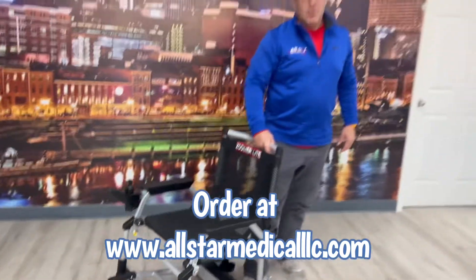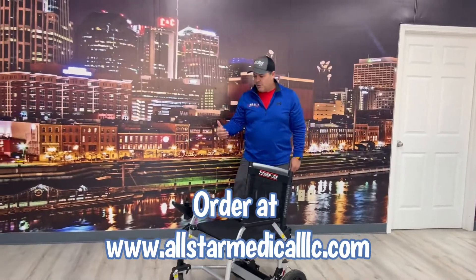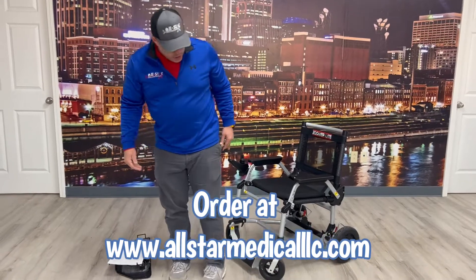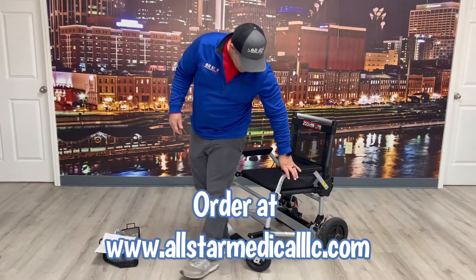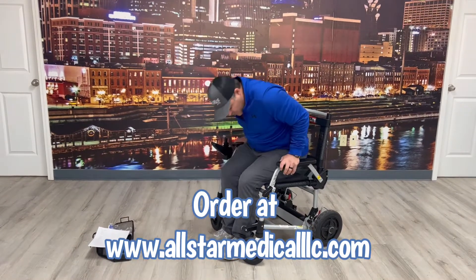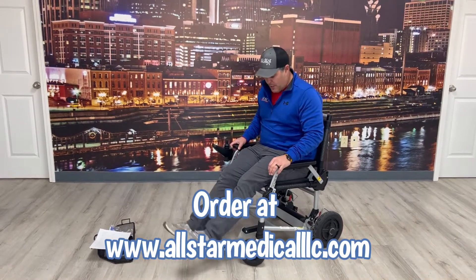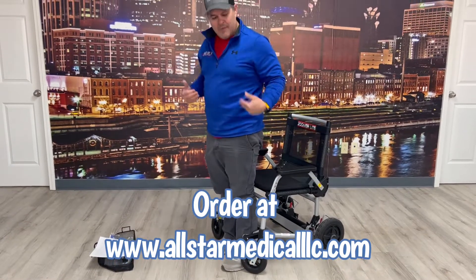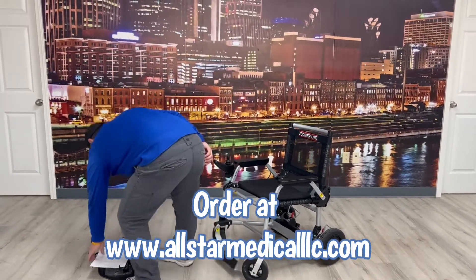The other thing I like — and this is also on the Zoomer and Zinger — is when you go to sit in the chair, see how the leg rest area moves. It gives you the ability to sit down by having the leg rest move back, so when you get in and out of it it's not in the way. That's a really nice feature.